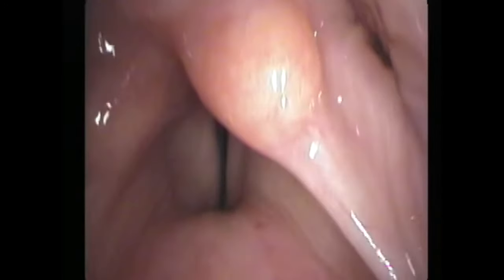Although both vocal processes were able to rotate the vocal cords to the midline for phonation, at this pitch, the left side has pushed the right vocal process laterally. As he goes up in pitch, the cricothyroid muscles pull tight and bring the right vocal process back into the midline.